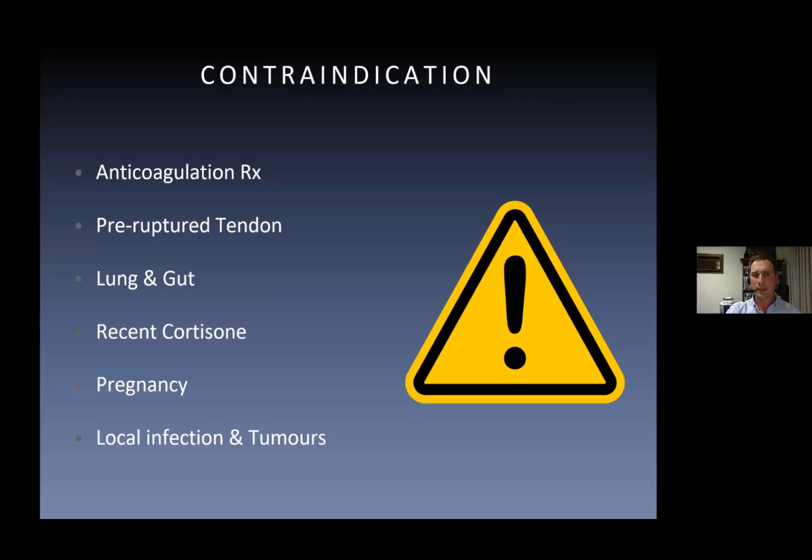Just to reiterate some of the contraindications. Contraindications to shockwave include anticoagulation therapy. Things like low-dose aspirin, I don't take as an absolute contraindication. I've treated patients on mild levels of anticoagulation therapy. In particular, I would use some common sense around that. The majority of things that I'm treating are all lower limb: the plantar fascia, patellar tendon, the gluteal tendon. These things are not overlying major vessels.